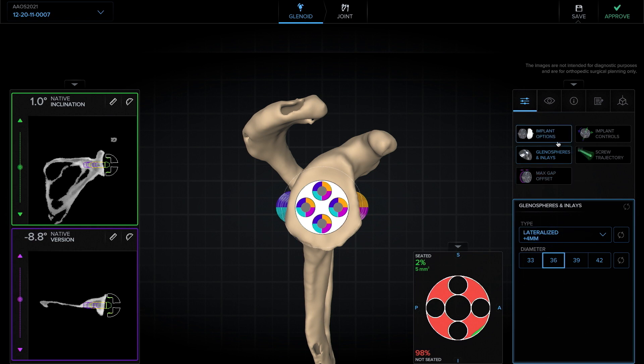The final thing I like to size before moving on to controls is the length of the screw or the post. Typically, that's going to be between a 25 and a 30 for me.